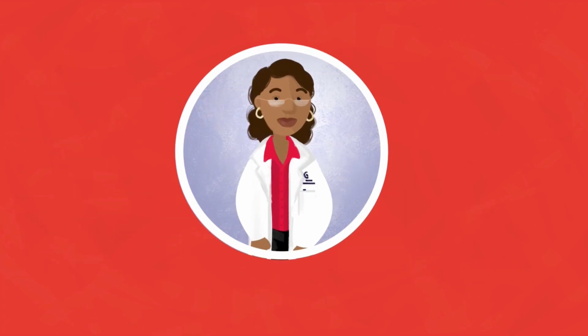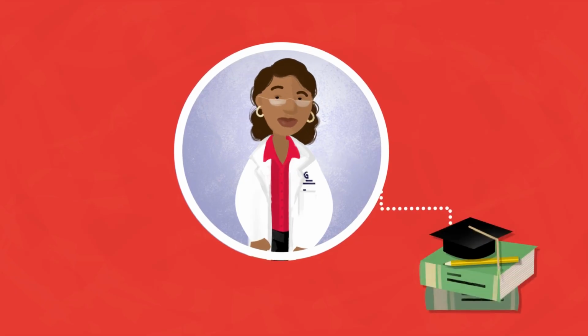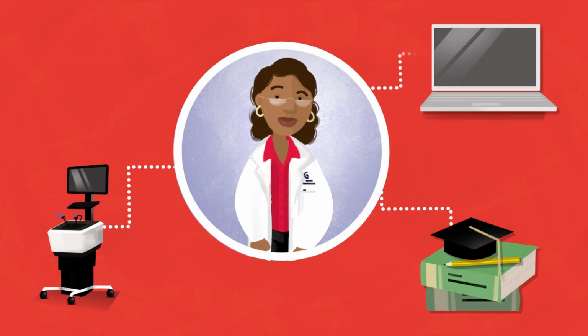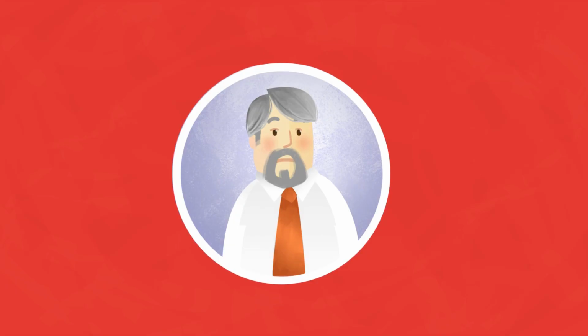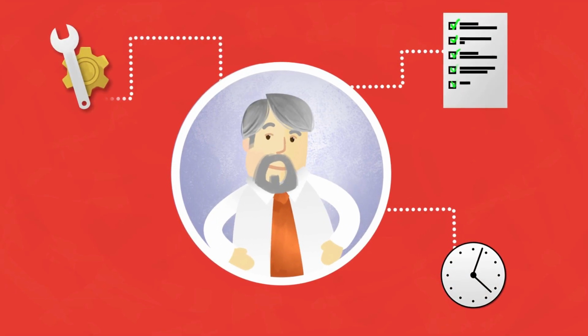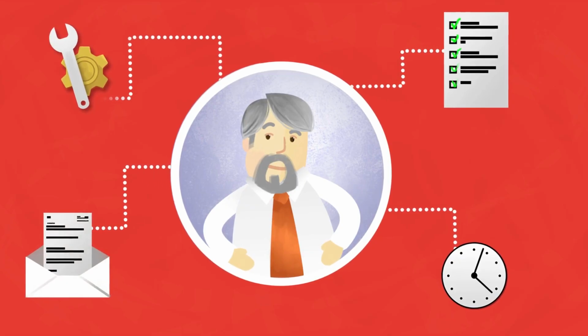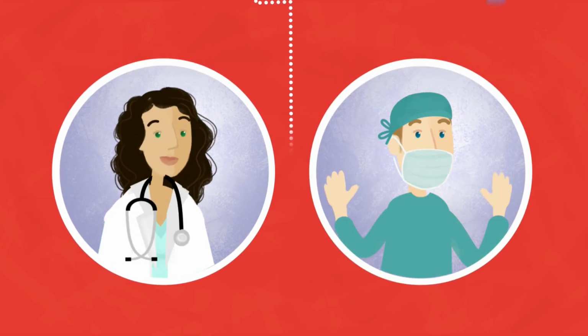This is Tammy, a professor of surgery and the director of the Simulation Center. She is responsible for the development and implementation of simulation-based curricula. This is Jim. He oversees the simulation lab and equipment and performs the administrative tasks of the simulation curriculum. These are Julie and Paul. They arrived at the hospital and are ready to start their training.